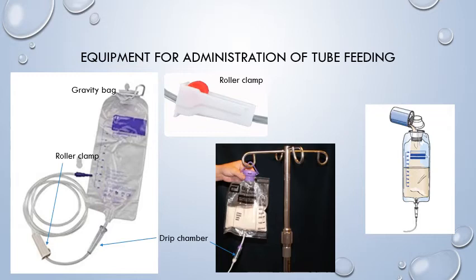When a gravity bag is used, the initial water, medications, and water are always administered by bolus method. Only supplement and the doctor-ordered water flush are administered through the gravity bag. For a gravity flow tube feeding, it will take approximately 60 to 90 minutes to complete.